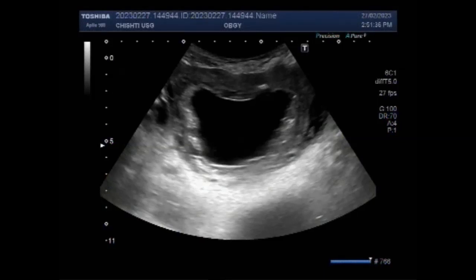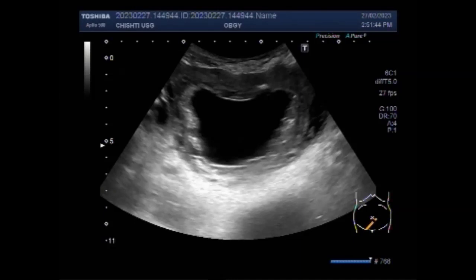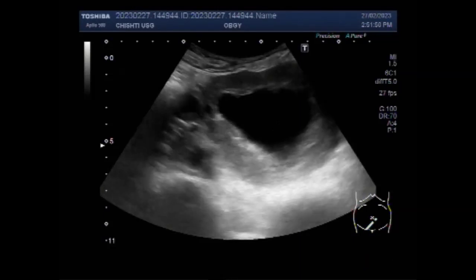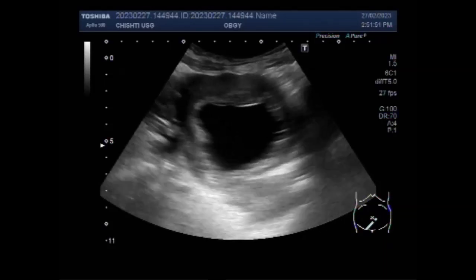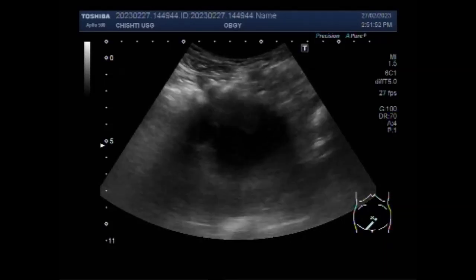Dear viewers, I hope you are all fine. This ultrasound video shows a case of empty gestational sac in the uterus without any fetal pole in it. You can see the uterus having an empty gestational sac.